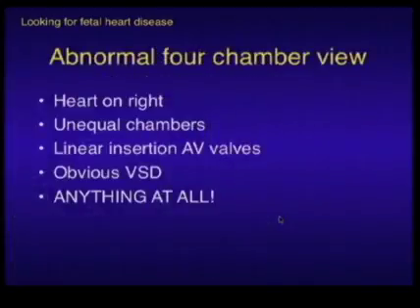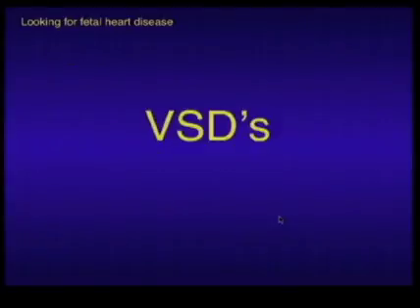What's abnormal? Well, it's anything that's not normal. Anything that disturbs you, that makes you think that things just don't quite look the way they should really prompts a more detailed look at the heart. The heart could be on the right, the chambers could be unequal in size, we could have funny insertion of the valves, an obvious hole, anything at all that gets you concerned. So let's look at some examples.